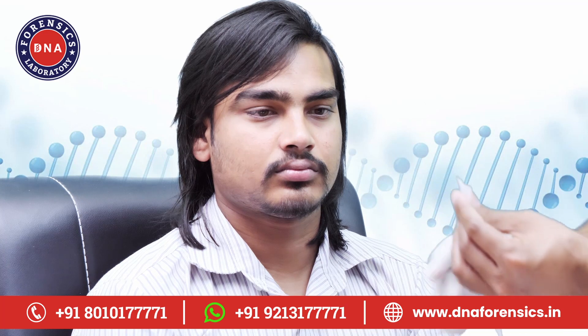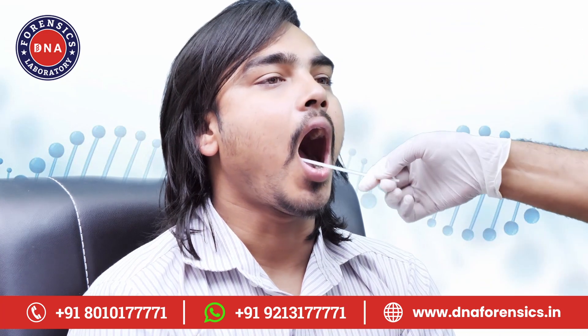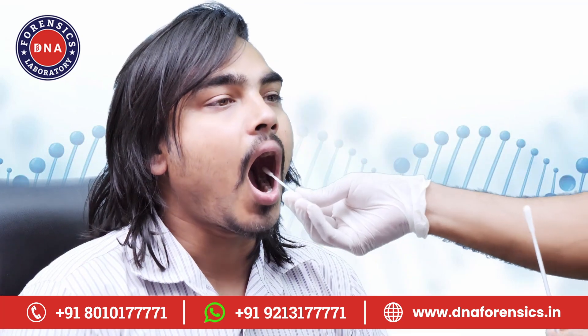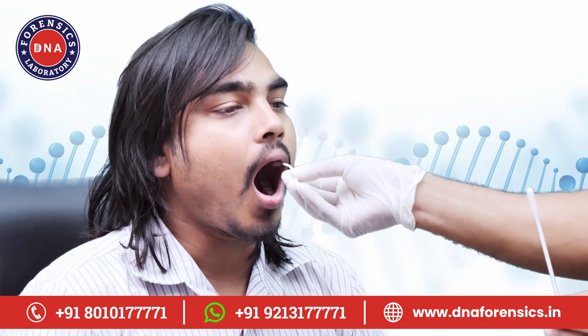Now tear the back and take out both the swabs, then rub a swab on your mouth cheeks from inside with a circular up and down motion. Now repeat the same process on the other cheek with the other swab. Each swab has to be rubbed for approximately 40 to 60 seconds.